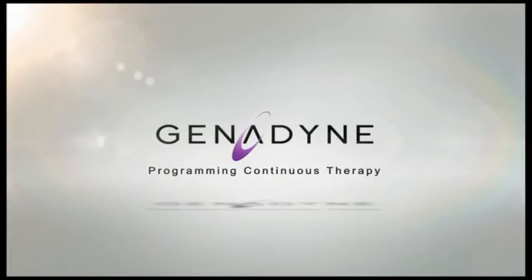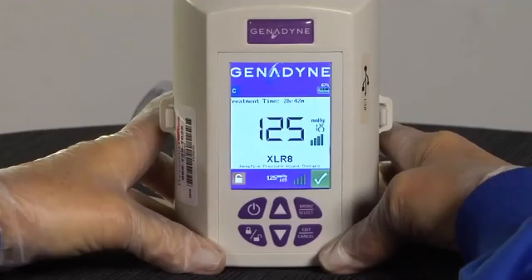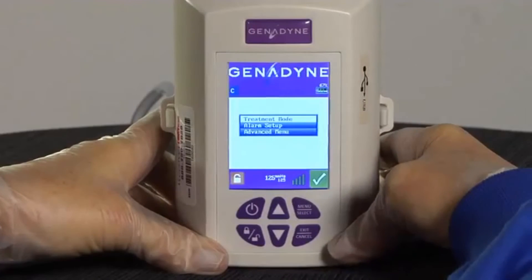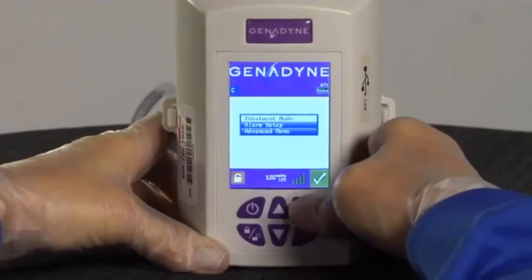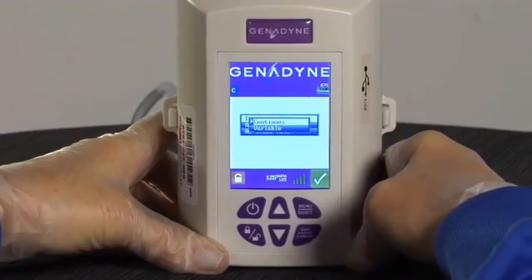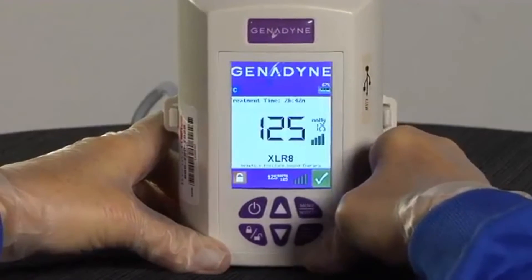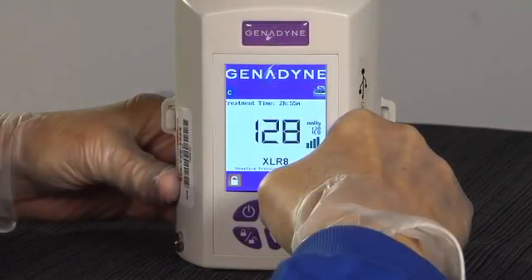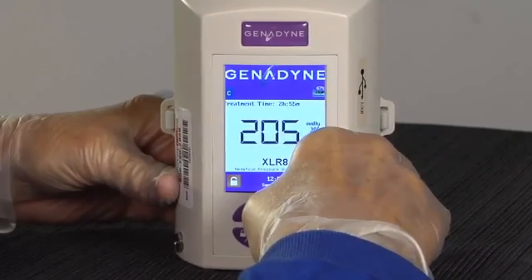Programming Continuous Therapy. To program Continuous Therapy, first turn the pump on by pushing and releasing the On-Off button. Press the Menu Select button; the menu will appear. Use the Up or Down button and choose the Therapy Mode function by pressing the Menu Select button. Select Continuous and press the Menu Select button. Press the Exit Cancel button twice to return to the home screen. The C symbol will be displayed to indicate Continuous Negative Pressure Therapy. To quickly ramp up or down, hold the Up or Down arrow key and the pressure setting can be changed in increments of 10 mmHg.